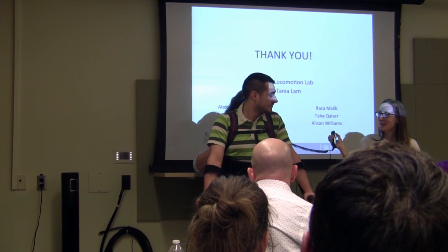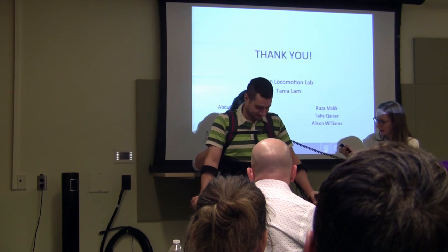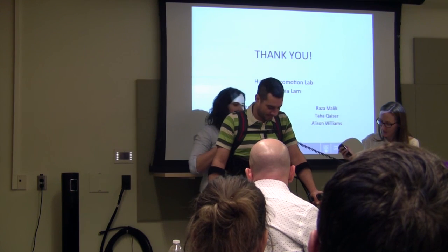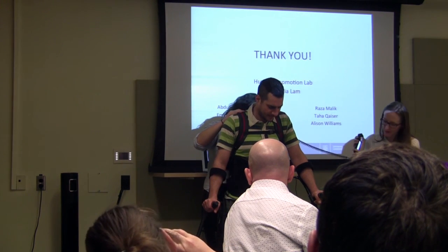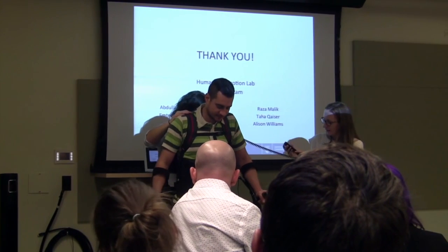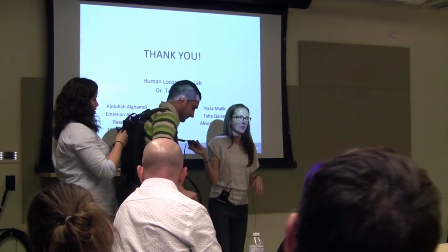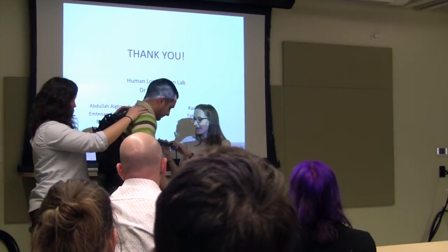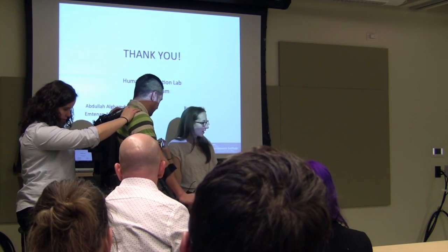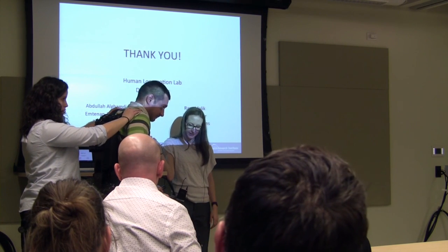Come back. Sorry, if I can turn, one step at a time. I can give you one step. It's a shift left, and then here we go. And then turn mode, and then you would just pivot your feet. And then I can go back to a walking mode. And then go back to your sit. Shift left. Yep.